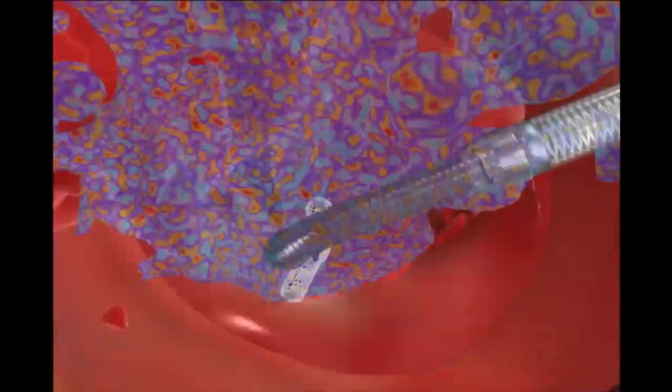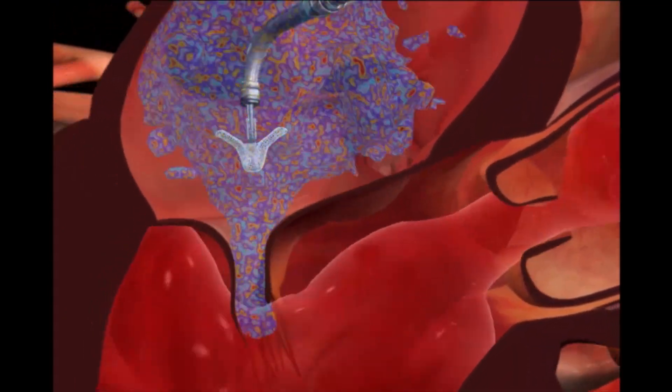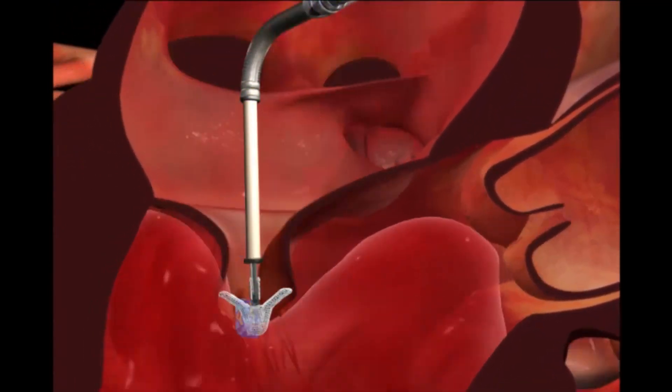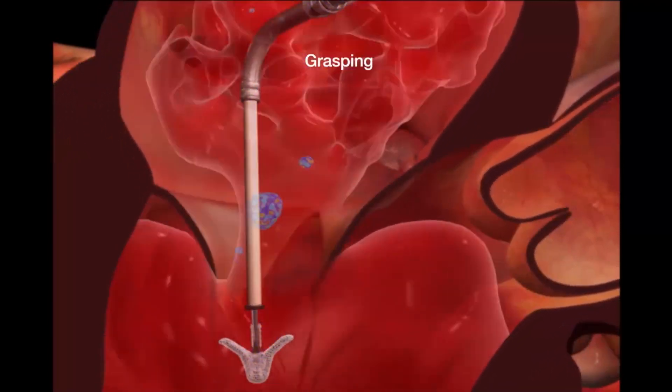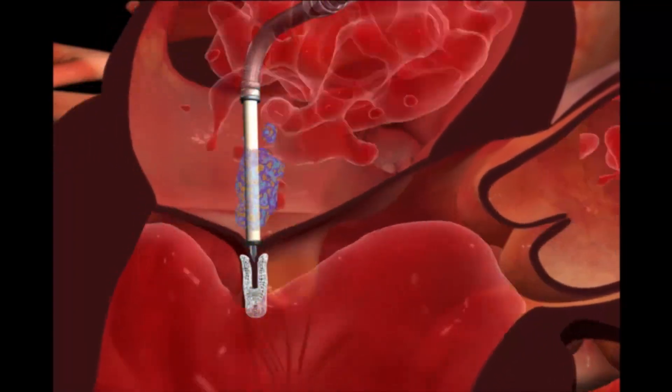Color ultrasound imaging identifies the severe MR, illustrated here with blue flow. The clip is advanced into the left ventricle below the valve leaflets. The clip is then retracted and closed to hold the leaflets together to reduce MR.